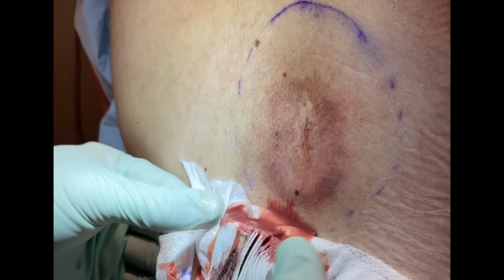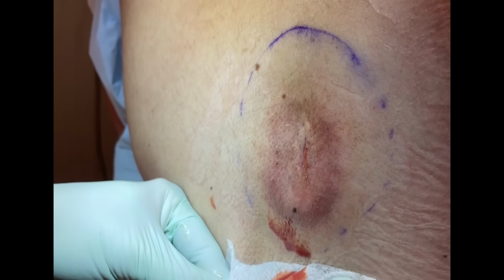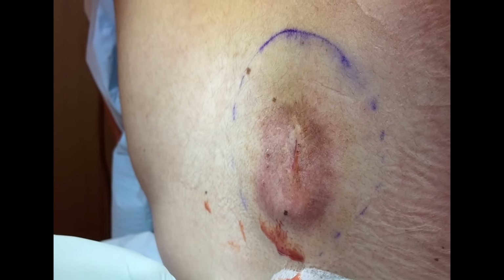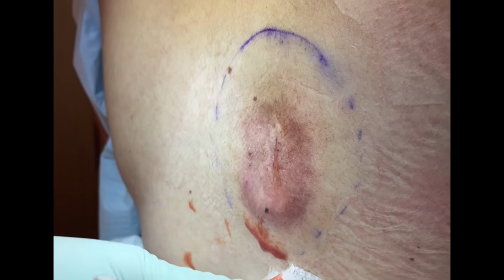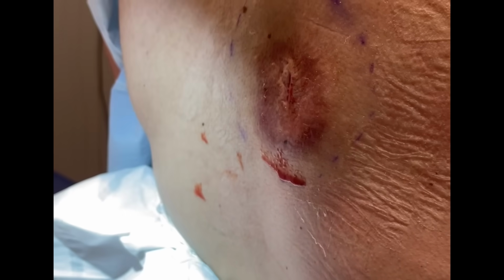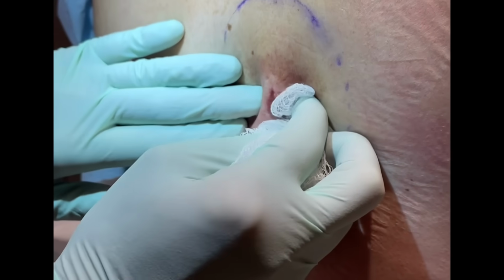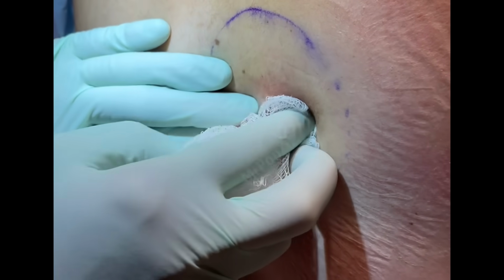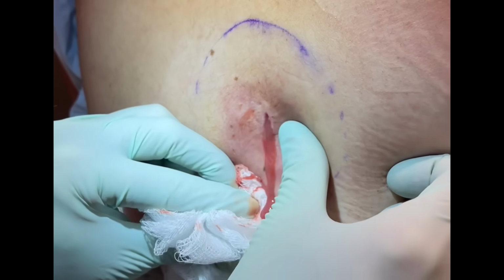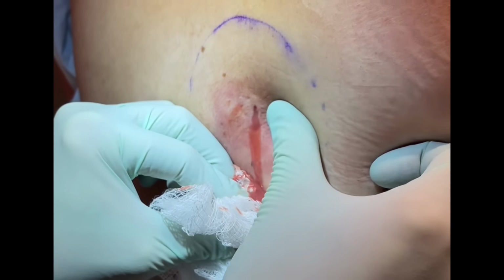But that change in color is what we want to see. It doesn't look like pus anymore. It's almost like serous fluid now, more of a yellowish brown, as that antibiotic takes hold here in the next 2 weeks. And we're going to get our culture back and see what type of possible bacteria you might have in there. So that's good. It's just a little bit of fluid in there, bottom of the pocket there. Not too painful? No. Good.